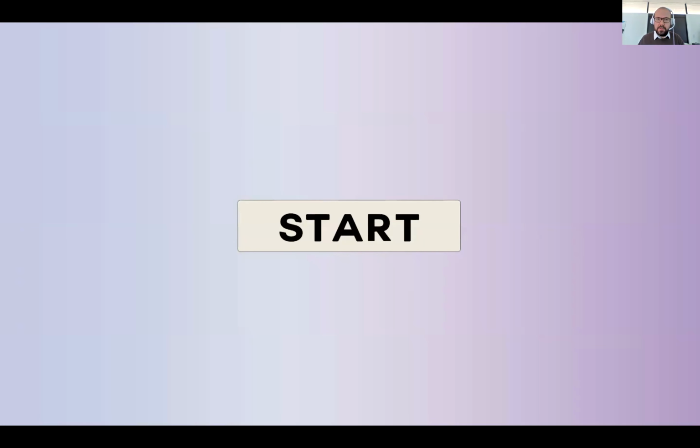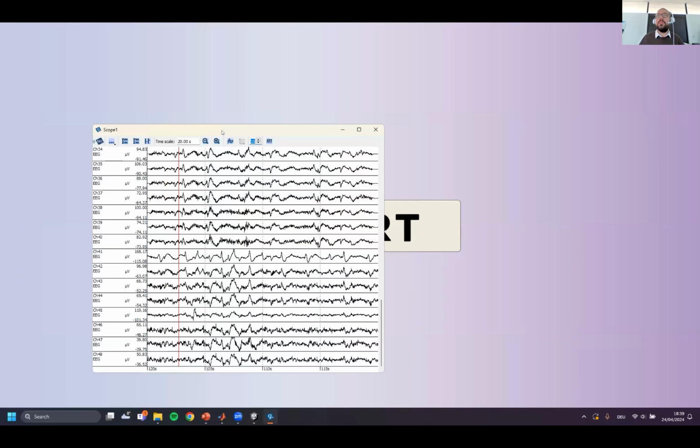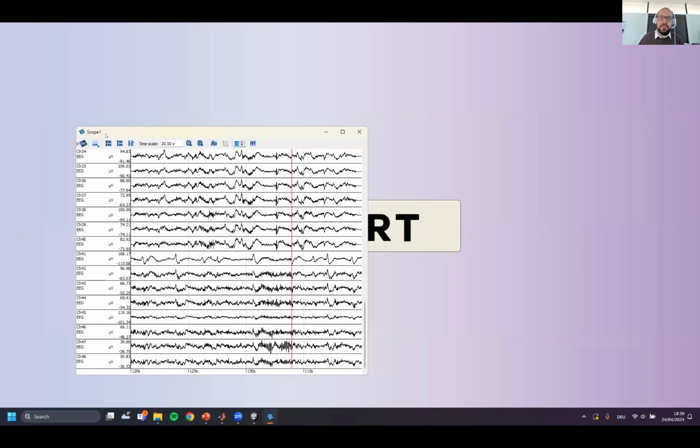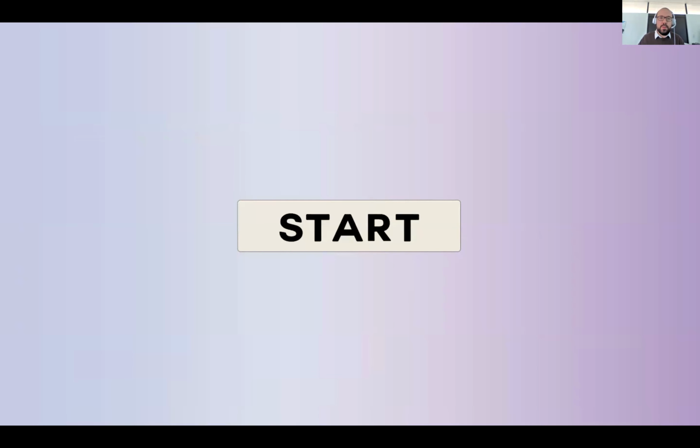So I can have a look at the data. Okay, close the eyes. That's good. Can you blink? I can see the blinks there. Okay, that's fine. So we can start the paradigm.